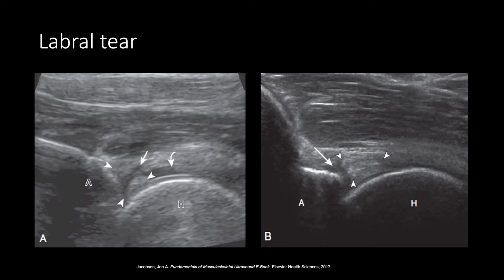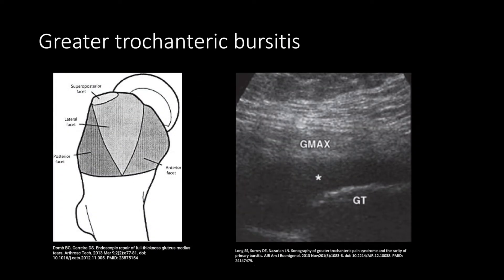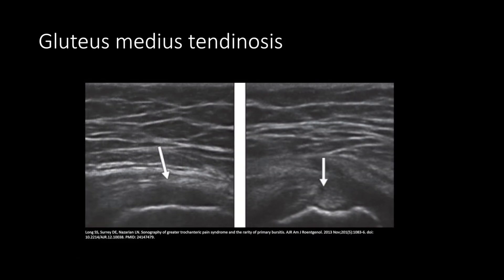The right image shows detachment, denoted by the white arrow, of the labrum, denoted by the arrowheads. Here we have some fluid between the posterior facet of the greater trochanter and the gluteus maximus muscle, suggestive of greater trochanteric bursitis. Ultrasound images of the lateral facet of the greater trochanter show a thick and hypoechoic gluteus medius tendon with loss of the normal fibrillar pattern, consistent with gluteus medius tendinosis.